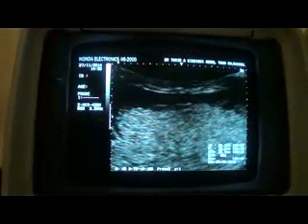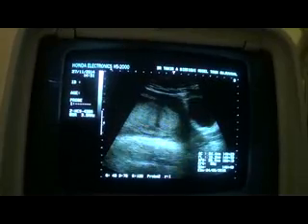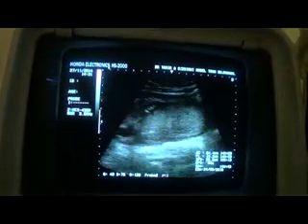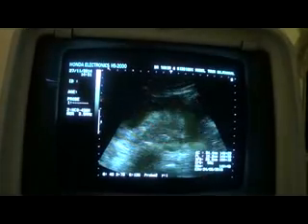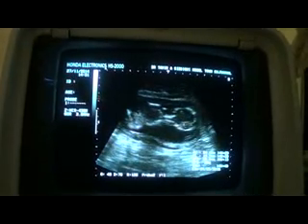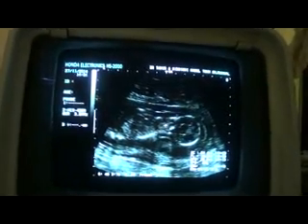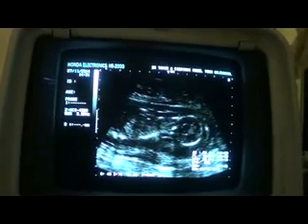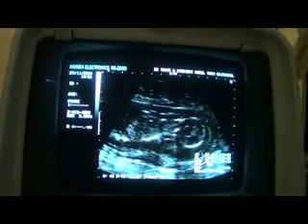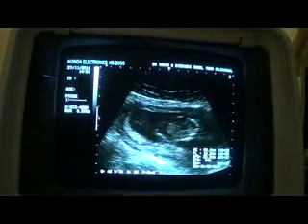So what we have studied so far is that there is a placenta previa, posterior wall, completely covering the os, grade 2 placenta, with edema of the scalp and the fetal abdomen. Here again you can see the fetal scalp edema. This is the scalp bones, and this is the edema, this part. And there is also edema of the abdominal wall.